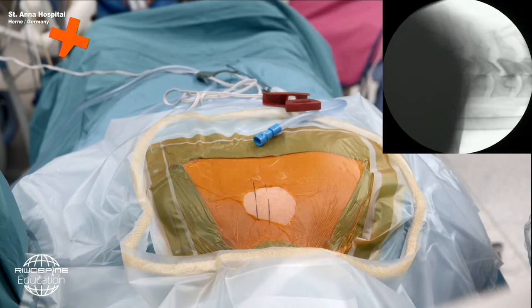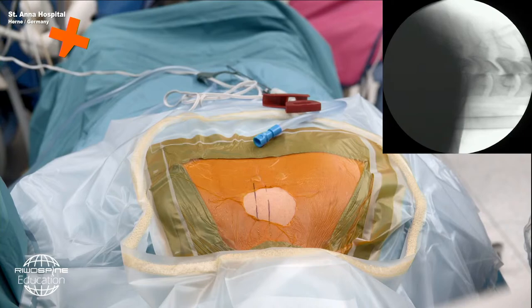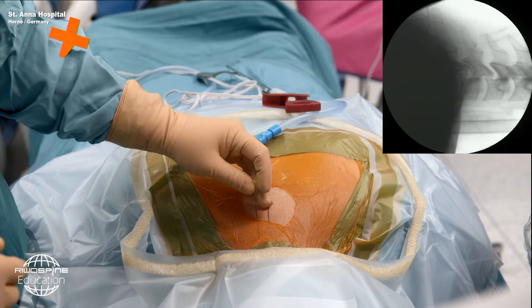So the problem always in men is, of course, the shoulders. We have some weights at the arms to pull the shoulders down. Now we mark the level that we want to operate, in this case C6, C7 on the right side. So we have to check just on the level.